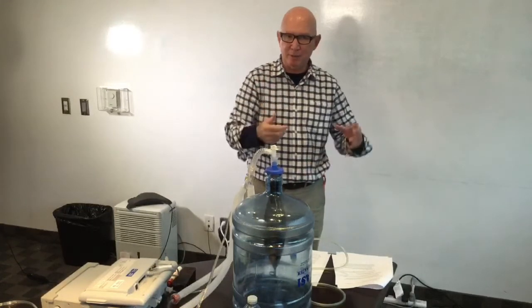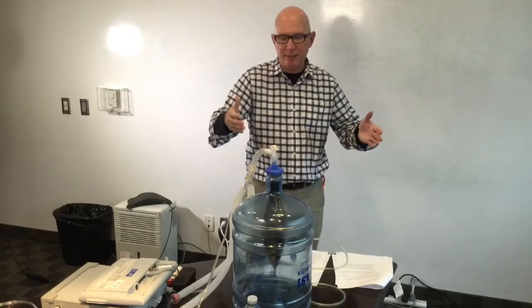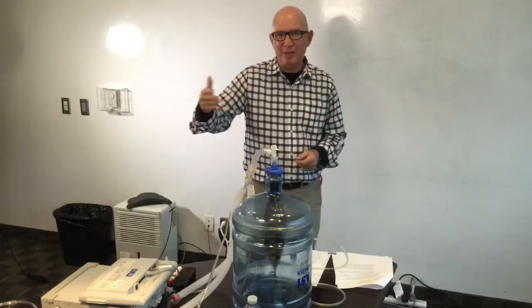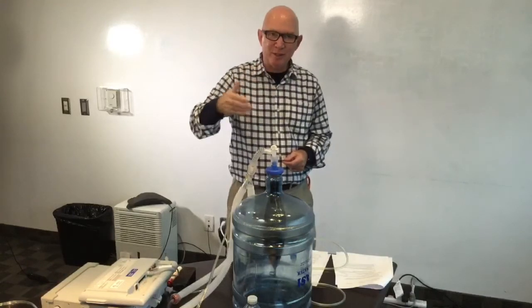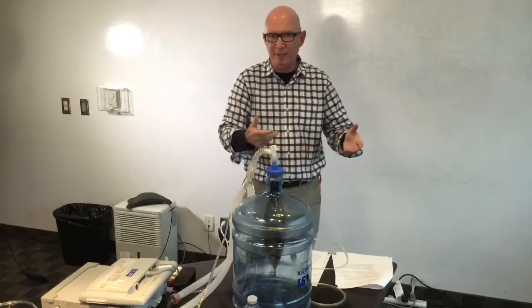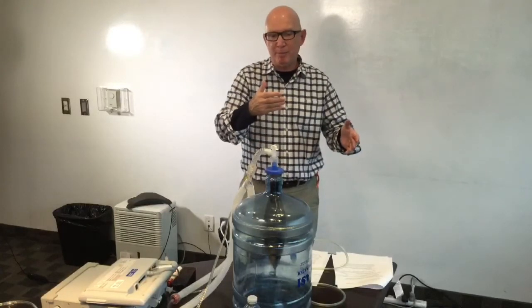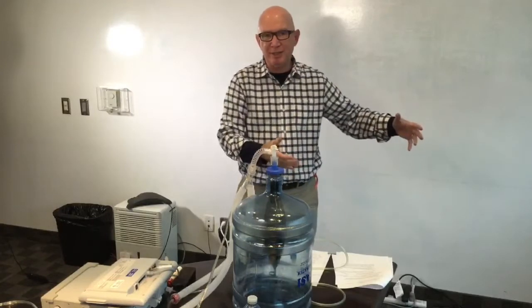And you might say, well, we know that an increase in intrathoracic pressure is going to affect cardiac output. But the important piece is that with every single breath the same, you can titrate your inotropes and chronotropes and fluid volume to get to a cardiac output which is reasonable for what you're actually doing to this particular patient.